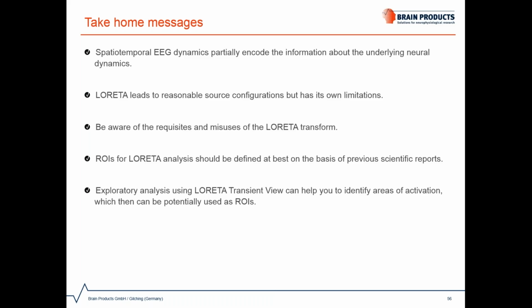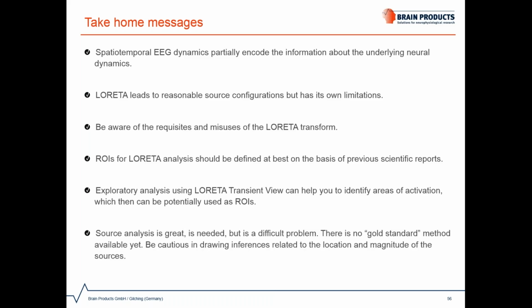In general, although source analysis is a difficult problem, it is really a great technique devoted to modeling and estimating the spatiotemporal dynamics of neuronal current sources throughout the brain. However, there is no gold standard method available yet, so be cautious when interpreting the results related to the location and magnitude of sources.